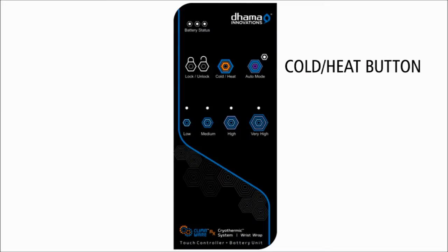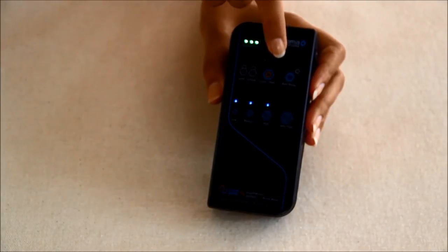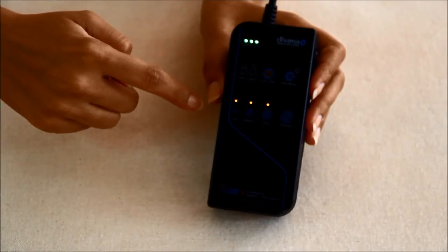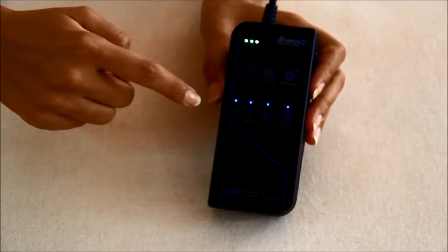Cold and heat button: this is also a toggle button. Press and hold this button to activate cooling or heating — cooling is selected by default. Press and hold the button again to change between cooling and heating mode. Touch the appropriate temperature level button to select the desired temperature level.